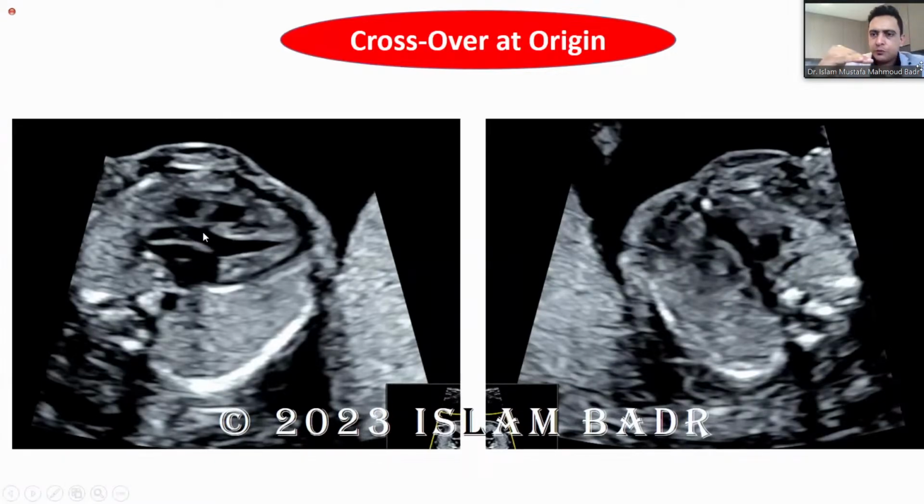the left ventricle. When you take your ultrasound transducer and swipe toward the upper mediastinum, you will see the three vessel view: the pulmonary, the aorta, and the superior vena cava. If you notice the orientation of the pulmonary and the aorta, and you convert this in your mind, this is a lower plane, this is an upper plane.